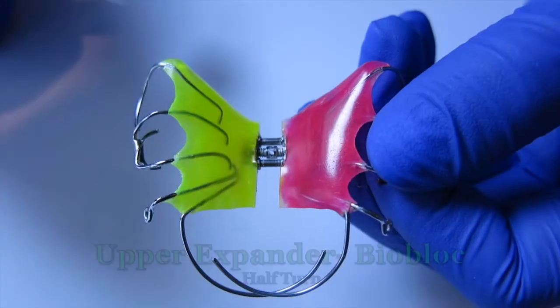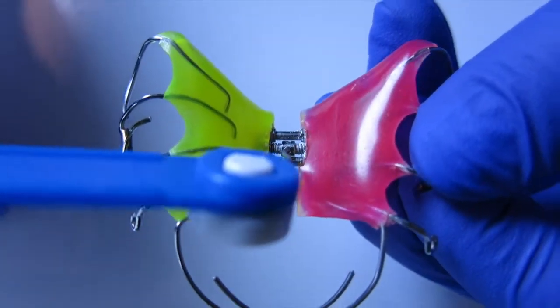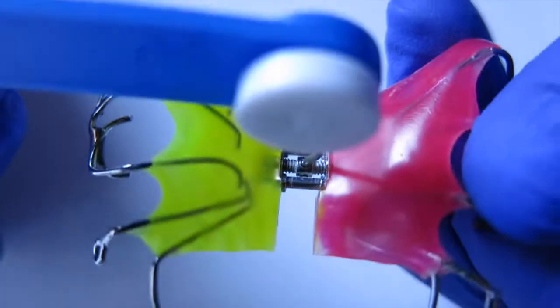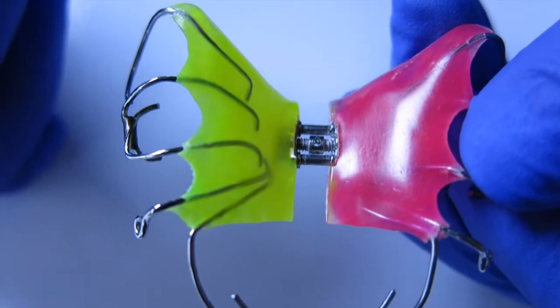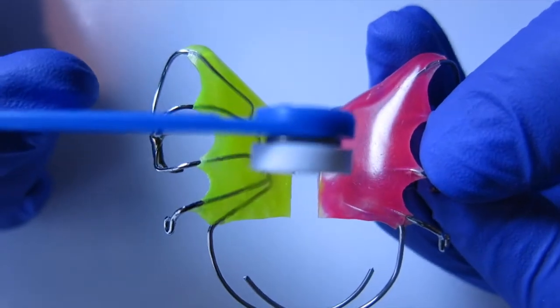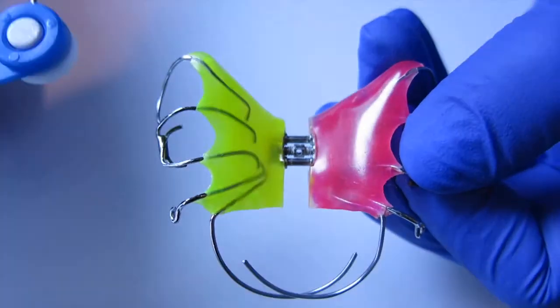Now I'm going to teach you how to do a half turn. From the very front, the first hole, place your key in the hole and bring it all the way to the middle. That's a half turn. Now to complete another half turn for the next day, place the key into the hole in the middle and bring it all the way to the back. And a new hole should appear in the front.